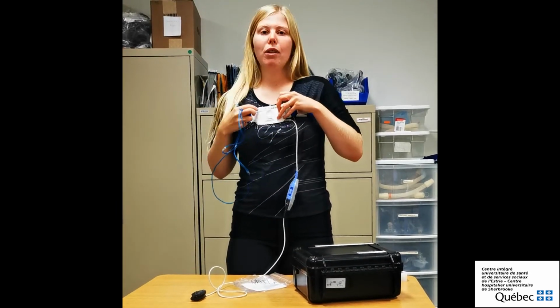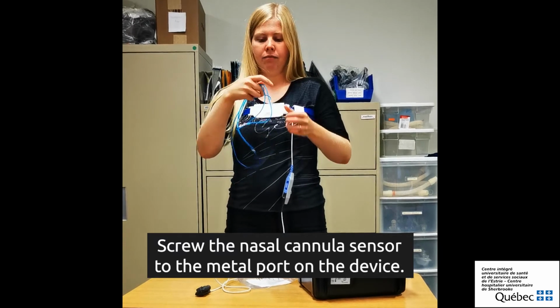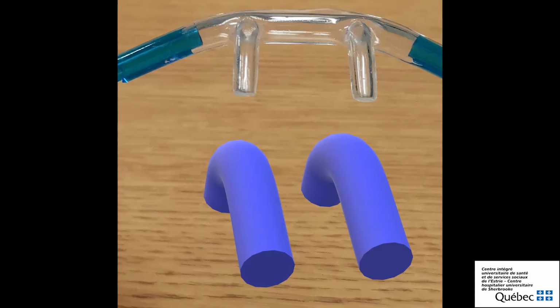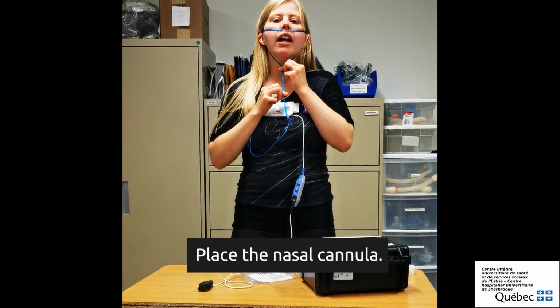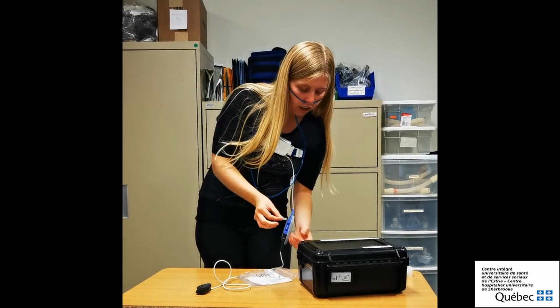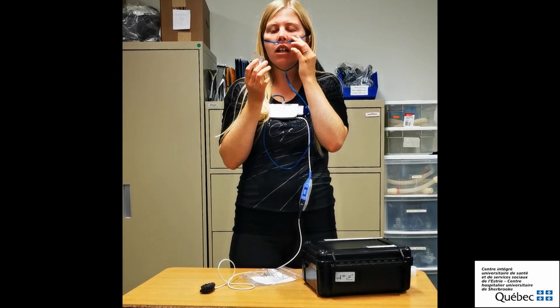Next, you need to make sure that the metal part of the machine is towards the top and screw the tubing from the nasal cannula there. There is a curve in the nasal cannula. You'll want to put the curve towards you so that it goes in your nose, then pass the tubing around your ears. Bring up the plastic part around the tubing to get a snug fit. To finish, you will need to put a small piece of tape on each side of your cheeks to make sure that the nasal cannula doesn't move during the night.